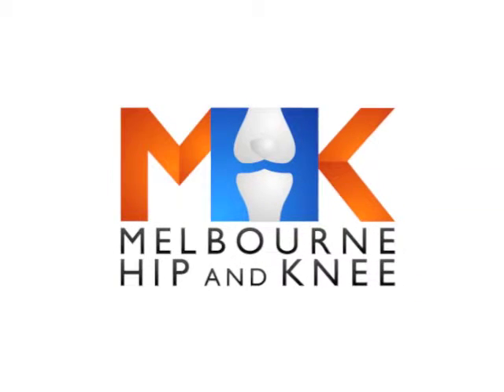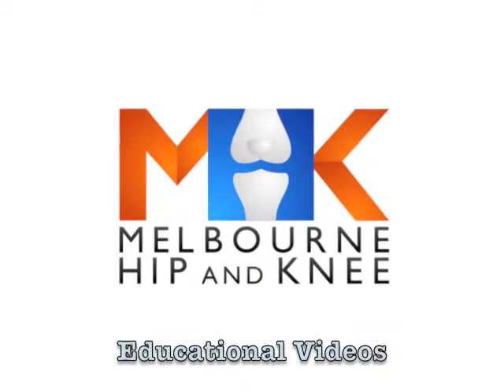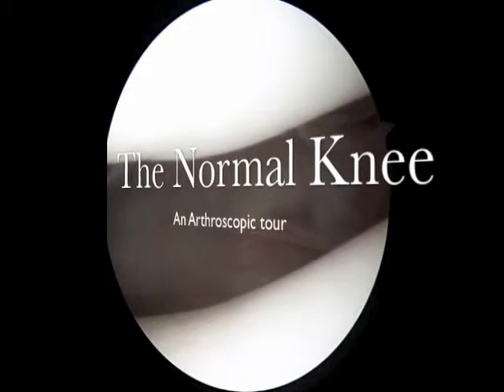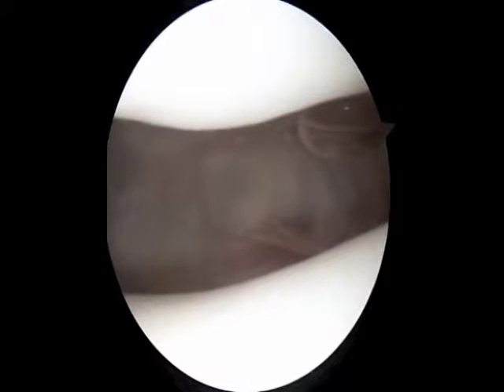Welcome to Melbourne Hip and Knees educational video on the normal knee, an arthroscopic view. In an arthroscopy, two holes are made at the front of the knee through which a camera and instruments are inserted.